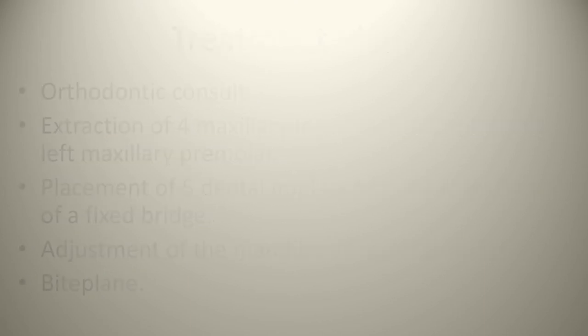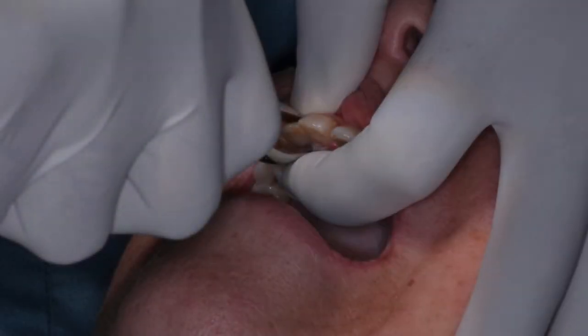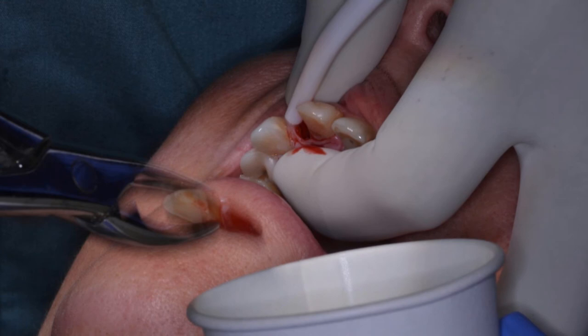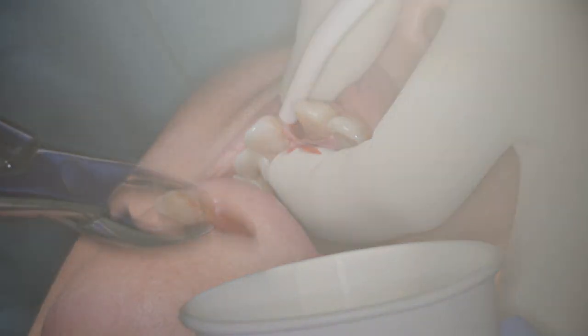So you can see in this photograph here, we're taking our index finger and our thumb to feel the bone and rotate, and get an atraumatic extraction of the central incisor. If one's not familiar with this, we do have a few case presentations highlighting how to do an atraumatic extraction, or as I like to term it, a minimally traumatic extraction. So you can see in this photograph, the first tooth has been taken out. And here's that extraction socket, just the residual socket that's remaining.